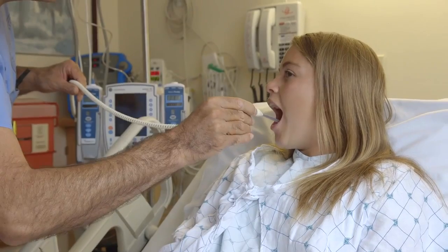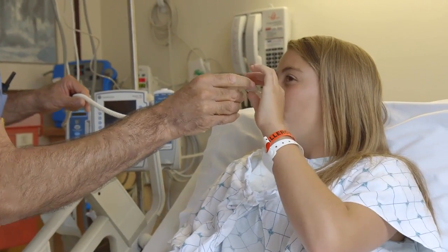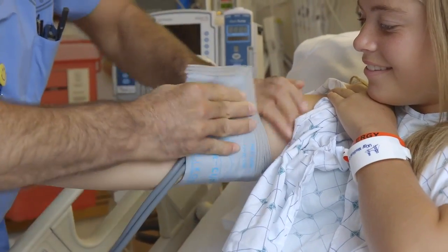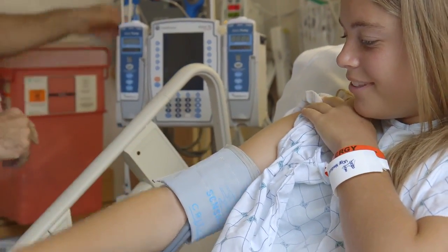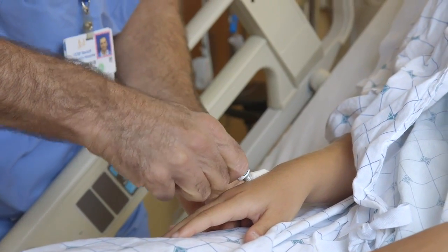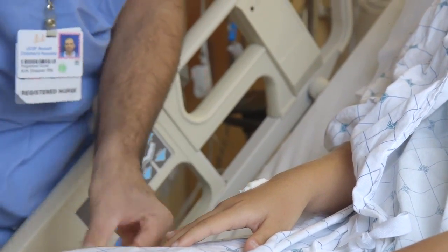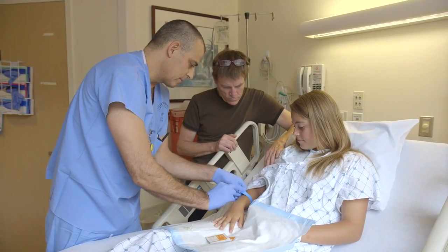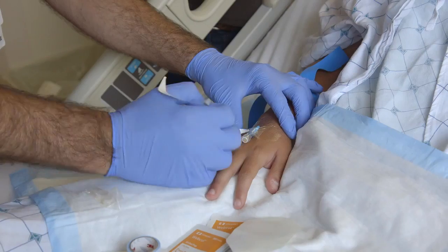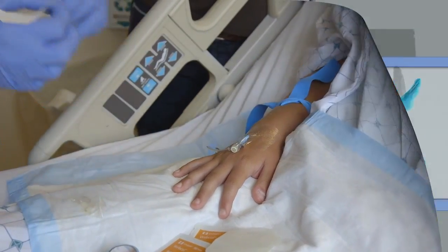Once in the procedure room, ECG leads will be attached to your chest to monitor your heart rate and rhythm. The selected areas for insertion of the catheters will be shaved and washed with an antiseptic to ensure that they are clean. The most common entry site is your right groin, but occasionally the left groin, neck, arm, or wrist may be used. You will be given sedative and pain medications through your IV.